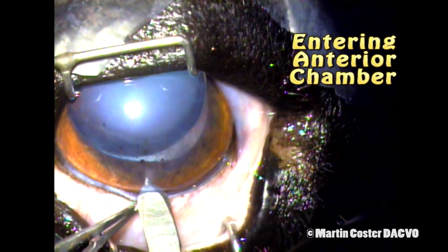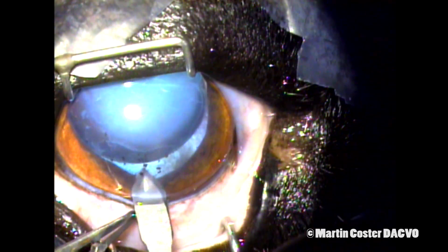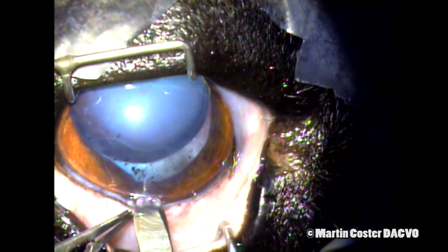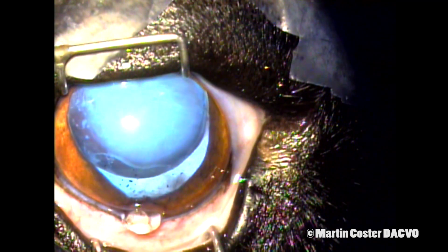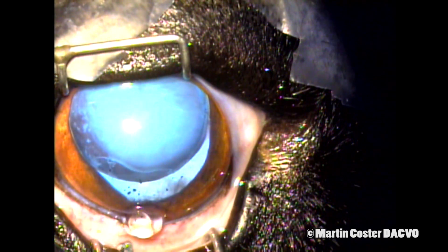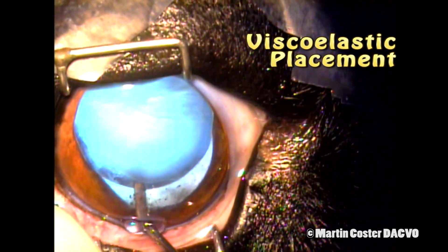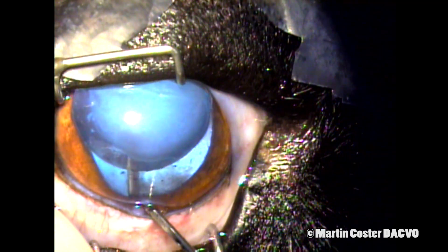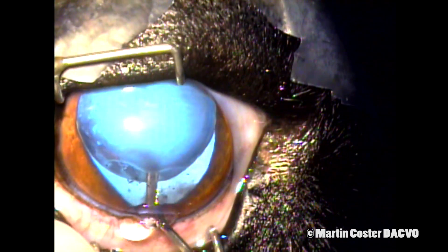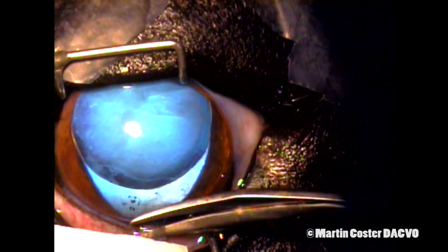Once the corneal incision has been made, we then incise into the eye using this keratome. This is a three millimeter stab incision and you'll see the vitreous being released from the eye. There's some pigment admixed with the vitreous that is also coming forward. We use a viscoelastic agent such as hyalatin to maintain the shape of the globe, to help with lens positioning and to keep the iris out of the corneal wound.